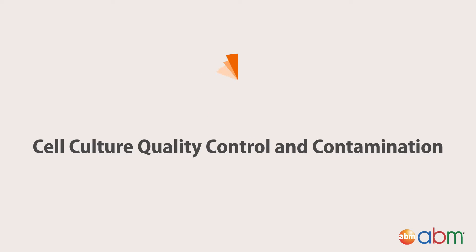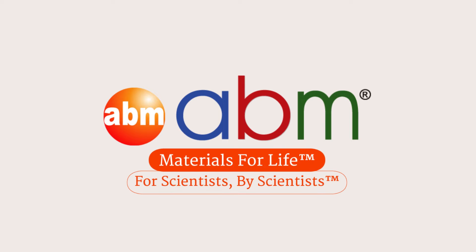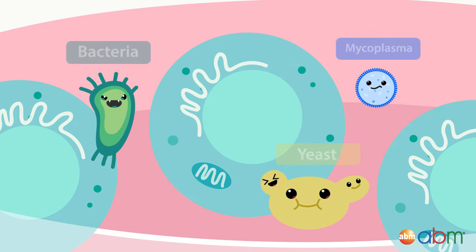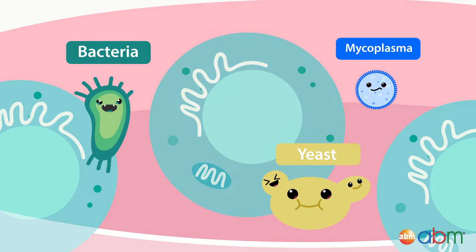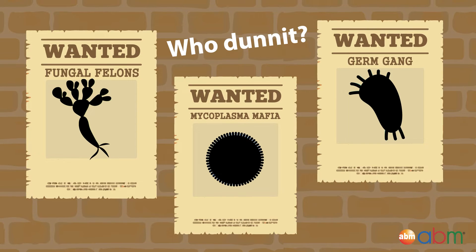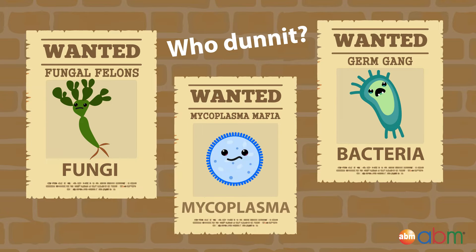In this video, you'll learn about the types of contamination, detection methods, and solutions to combat this prevalent issue that occurs in many cell culture labs. Contamination occurs when cells are exposed to foreign substances which compromise cell culture quality and can harm the cells. There are multiple types of biological contaminants. Today, we'll be focusing on the most common ones: bacterial, fungal, and mycoplasma contamination.